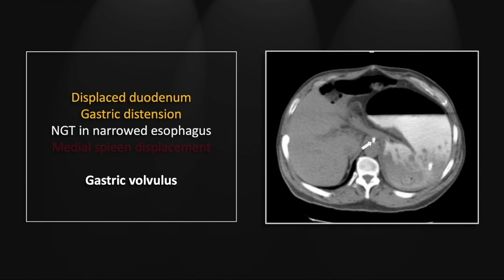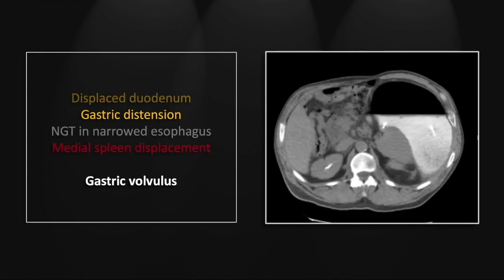In addition, follow the nasogastric tube, especially on the movie version, which will really help you identify the location of the gastroesophageal junction. On a lower cut, you can again appreciate the dilation of the stomach and the medial displacement of the spleen, which is often seen accompanying gastric volvulus due to the drag of the leonogastric ligament.